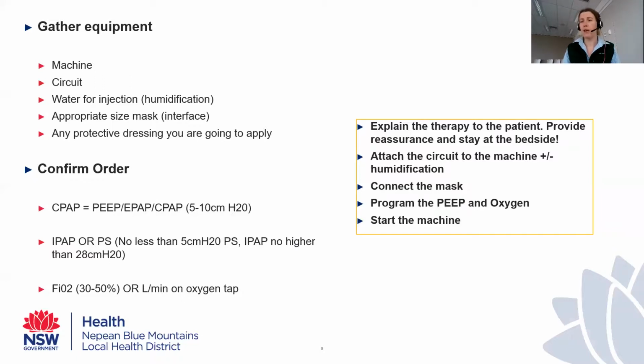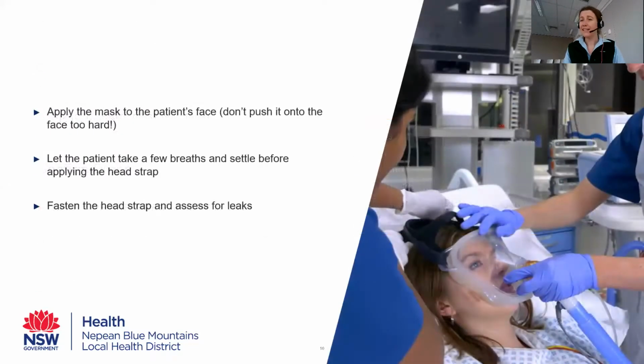You staying at the bedside and providing reassurance and support to the patient will be one of the big factors that leads to success with the initiation of therapy. So please don't leave. Some people, they'll take to it really quickly. Some people need 15, 20 minutes of reassurance. Some people need more than that, like you constantly going back to them and helping them concentrate on their breathing, take big breaths in, work with the machine, etc.